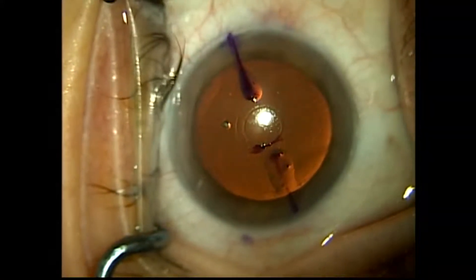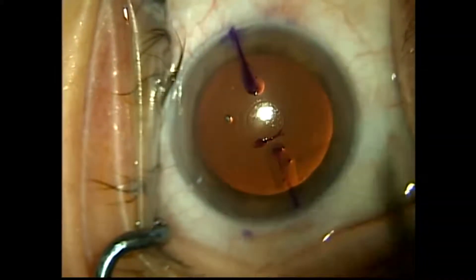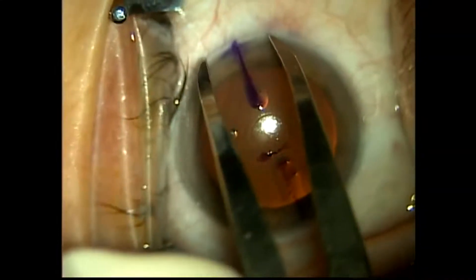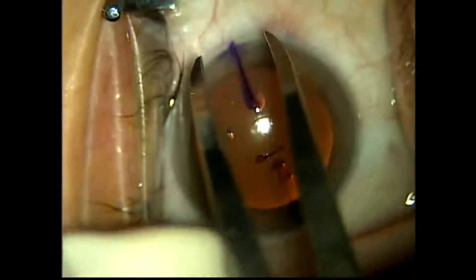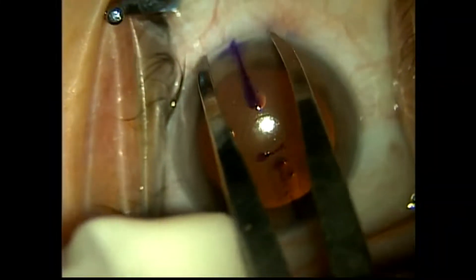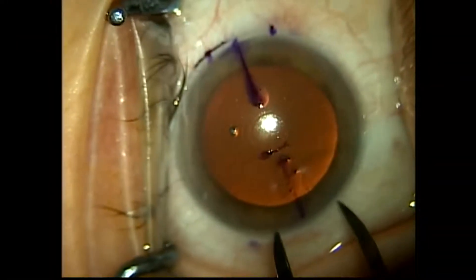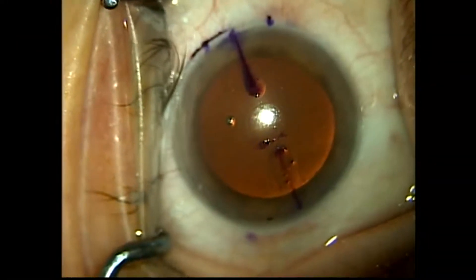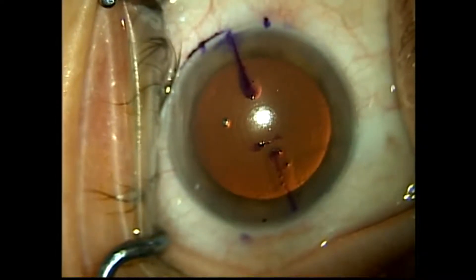I take a caliper and mark it off at 4 millimeters in diameter. I'm going to do a 4-millimeter limbal relaxing incision at axis 30, and I'm going to operate on the steep axis for my keratome incision.